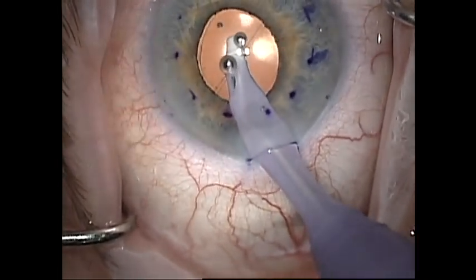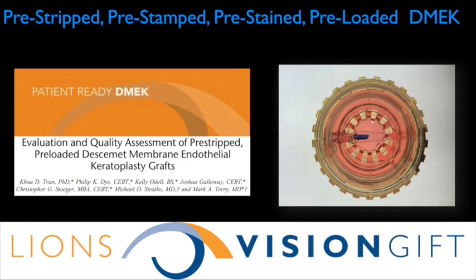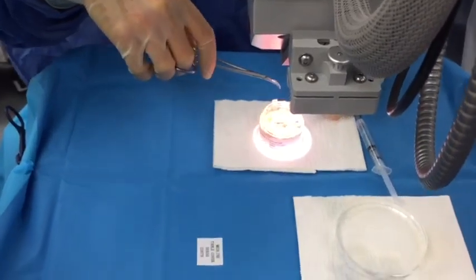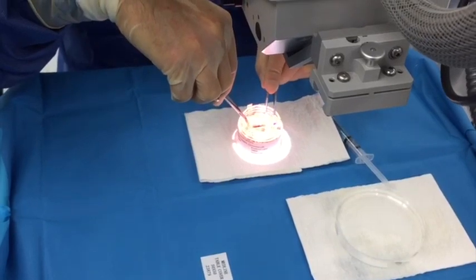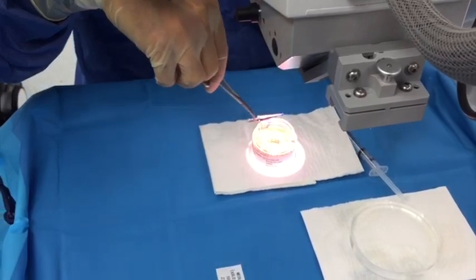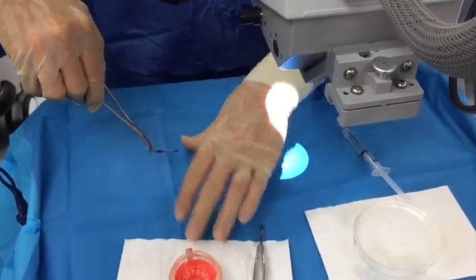I then remove all of the Helon from the anterior chamber. For about the last eight months I have been using DMEC tissue that has been pre-stripped, pre-stained, pre-stamped, and pre-loaded into the Stryko DMEC Jones tube inserter at the Lions Vision Gift Eye Bank in Portland, Oregon. The tissue comes loaded into a Krollman viewing chamber and the DMEC inserter and tissue can be removed with a hemostat using a second instrument for counter pressure on the non-sterile external surface of the viewing chamber.